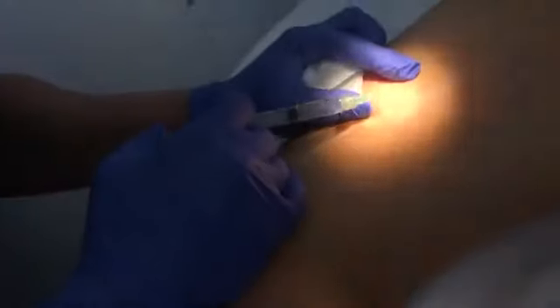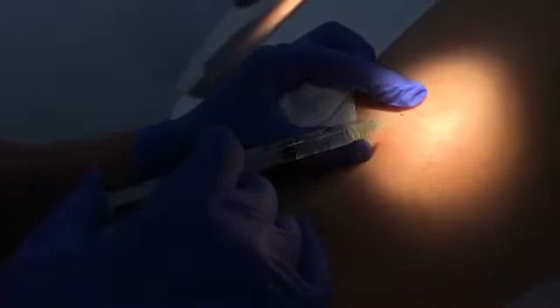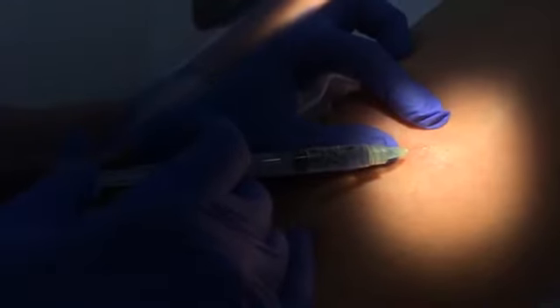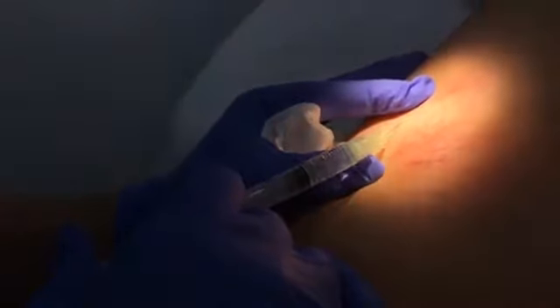And so the goal is to see in a few treatments how much reduction, but this is a very baby fine needle. Get some of these larger ones here. See that? That whole patch, you see? An entire patch was treated. And you can see the spasming starting to occur, the dark red color. There's another really good one right there. Great.